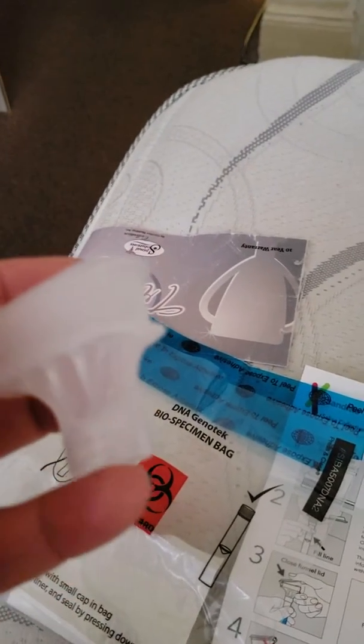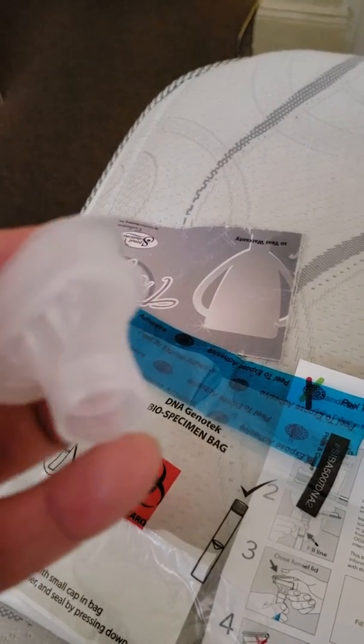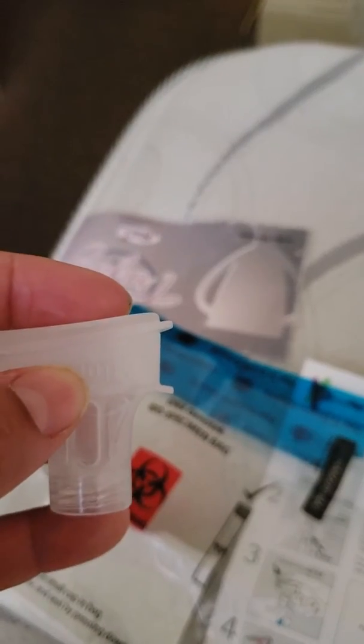You unscrew this from the bottle, and then you close the lid. That's what happens.